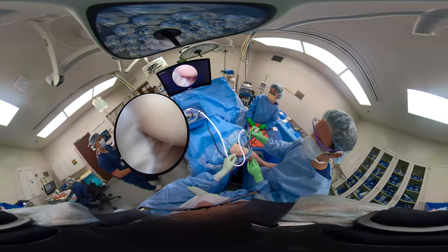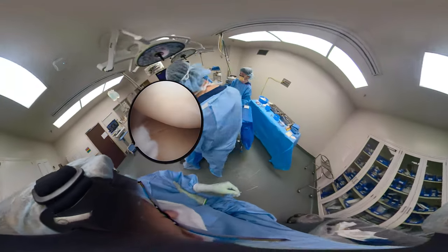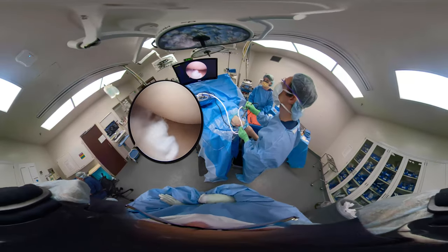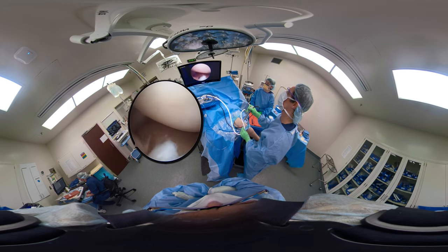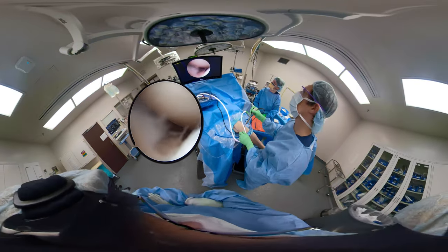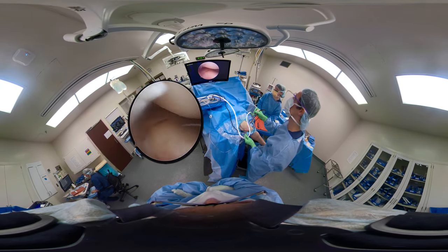We want to make a big enough incision to be able to easily get the instruments in and out. Remove the spinal needle. Keep your eye on where you're going to be coming in — you don't need to change that. Put your knife under direct visualization through that to establish the medial portal. You can see we saw on that back and forth and flip it 180 degrees to make a big enough incision where water comes out and we can easily get our instruments in for our working portal.